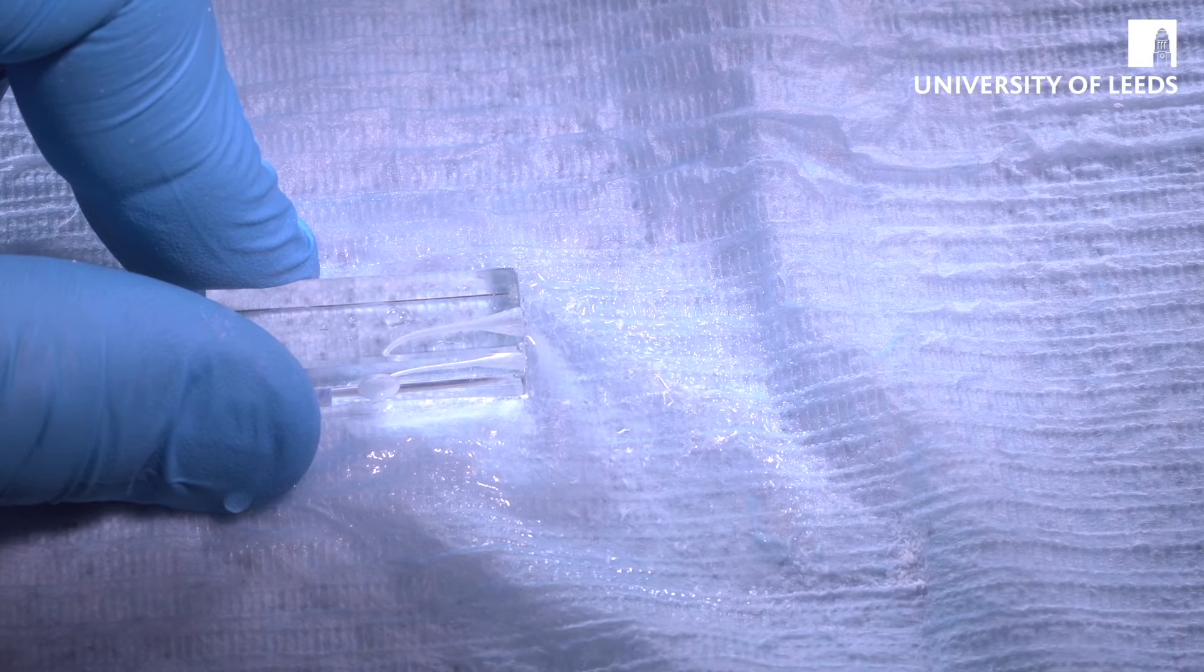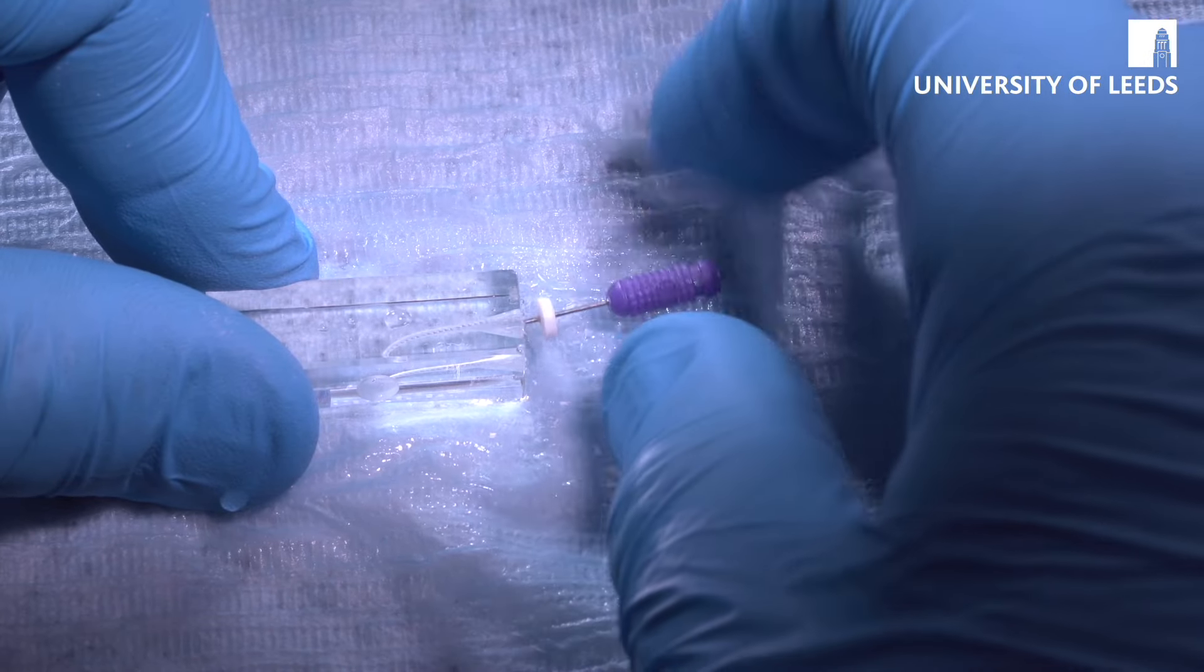Two, three passes, irrigate, patency file to remove debris, and that's it completed.